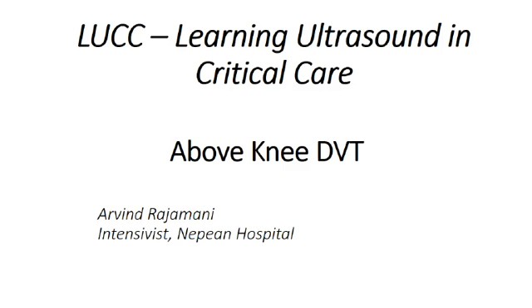I am an ICU consultant at Nepean Hospital in Sydney, and I have to confess I am not an expert in vascular sonography. So I'm not an expert on the diagnosis of DVT, but I can tell you that I've done enough of them to be reasonably confident that I won't miss a major DVT, which is finally what you're really interested in.